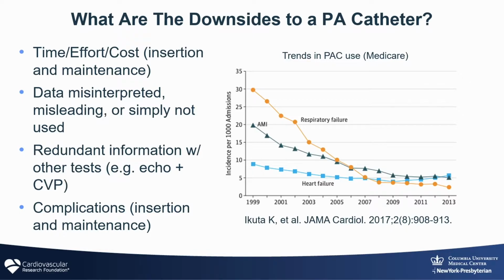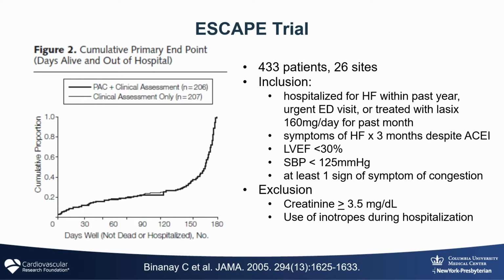The other thing I want to talk about a little bit in terms of a downside is that sometimes house staff education these days, you have lists, you have checkboxes, you have to do the EHR and everything, and on the checkbox list is put in a PA catheter. Box is checked, the PA catheter was put in, I did my job. Well, no, that's not enough. You have to know what to do with the data once the catheter is put in to be able to then manage the patient.